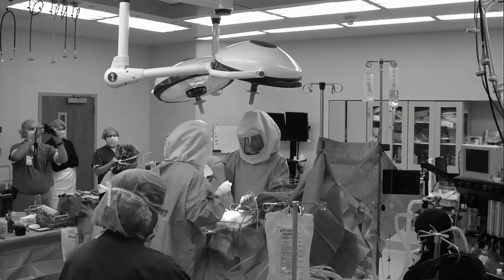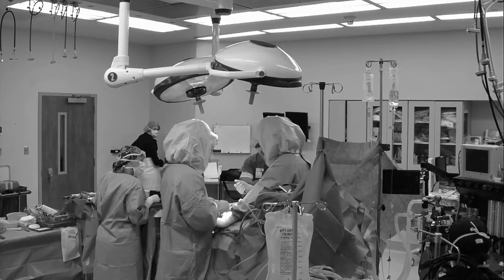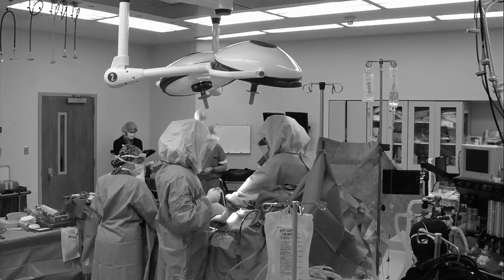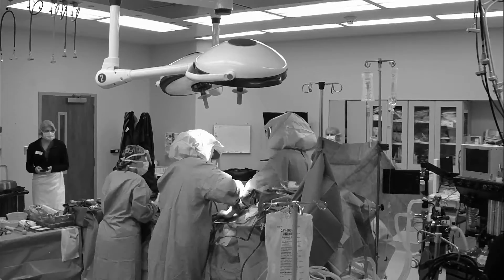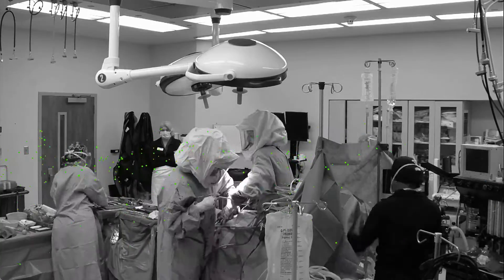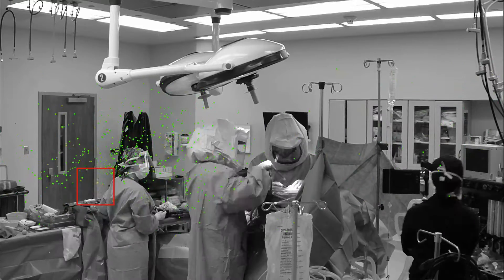Stopping the intrusion of these airborne organisms is an important element of preventing infections. Many common operating room dynamics affect the presence of airborne bacteria in the surgical field — for instance, the opening and closing of doors, and most importantly, room traffic and the movement of people. These disruptions cause the airflow patterns to become erratic, potentially bringing high numbers of infection-causing bacteria in contact with the surgical site.